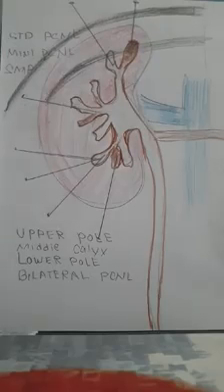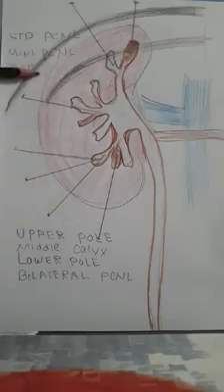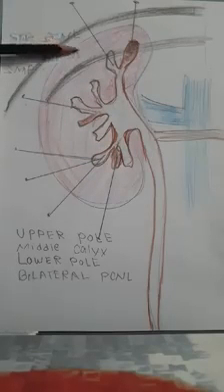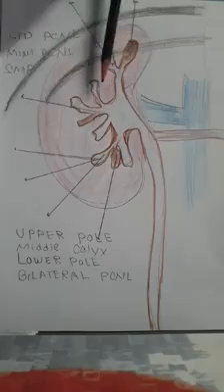And I think in super mini and mini PCNL I don't place a nephrostomy tube, but in standard PCNL, especially upper pole, I always leave a tube here.